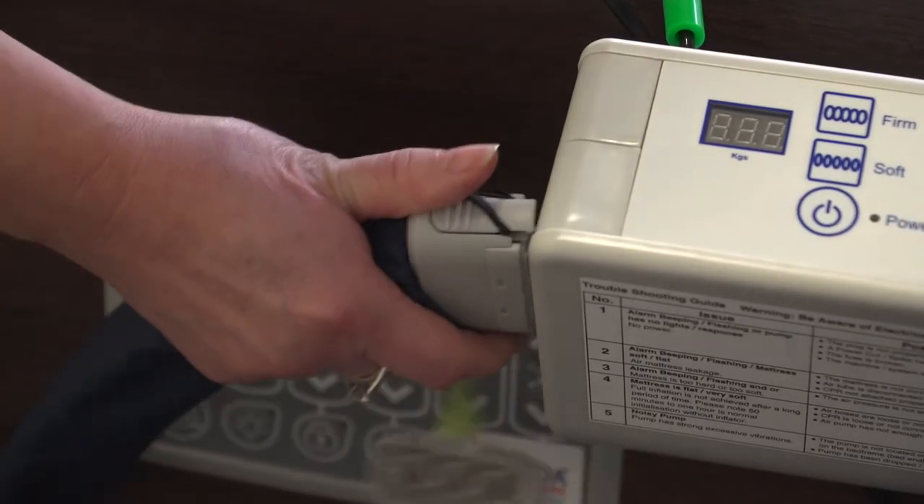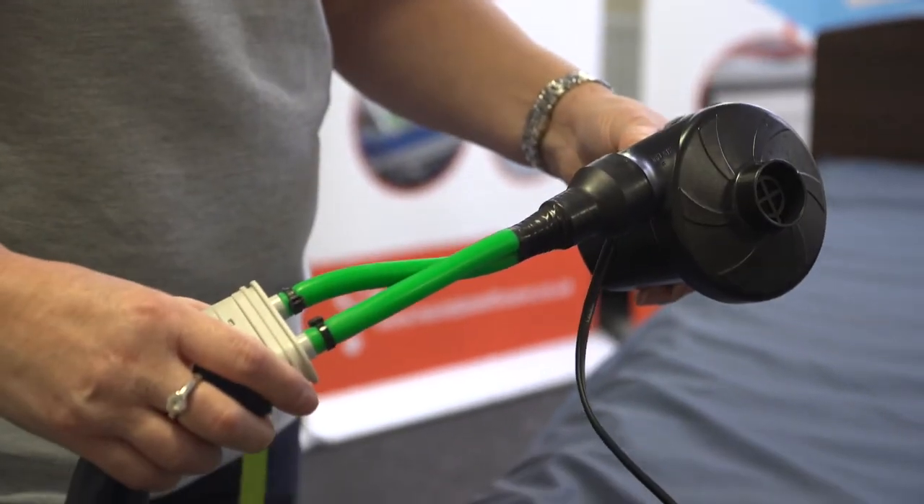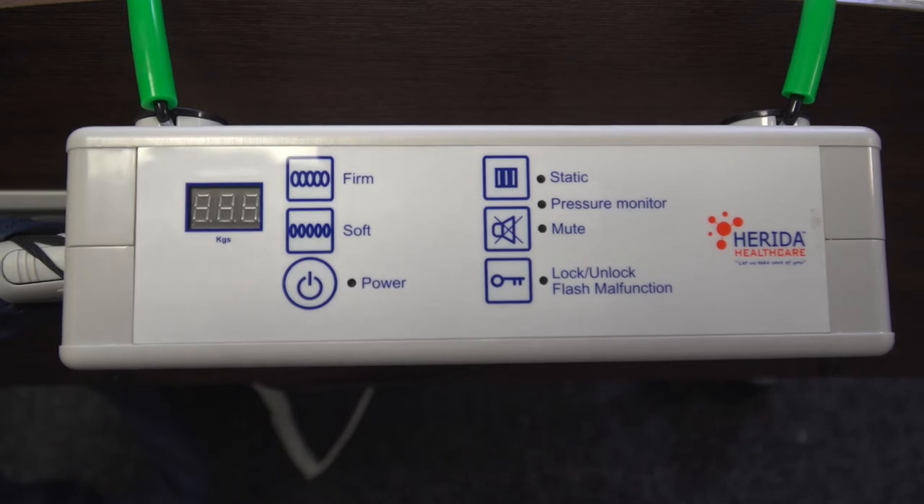Upon installation, the engineer will either turn the system on, leaving it to inflate by connecting it to the power switch. Normally, the engineer will use a rapid inflator, bringing the cells up to full capacity in seconds. The Herida Argyle II operates with a digital pump.